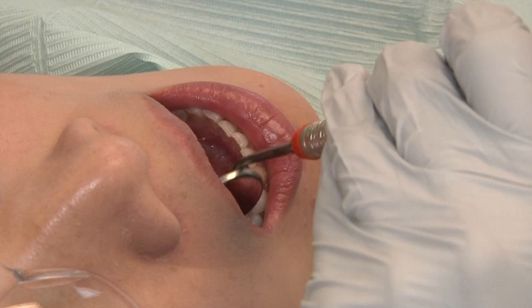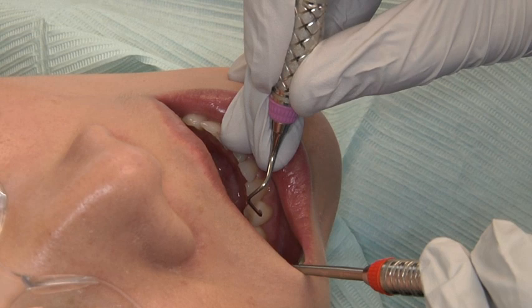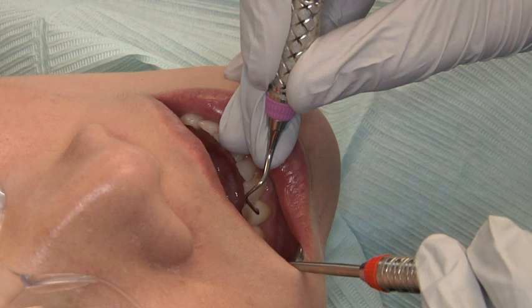Establish an intraoral fulcrum close to the working area and on the same arch while holding the instrument using a modified pen grasp. The ring finger should be kept straight, with the tip of the finger placed close to the working area and on the same arch, supporting the weight of the hand.